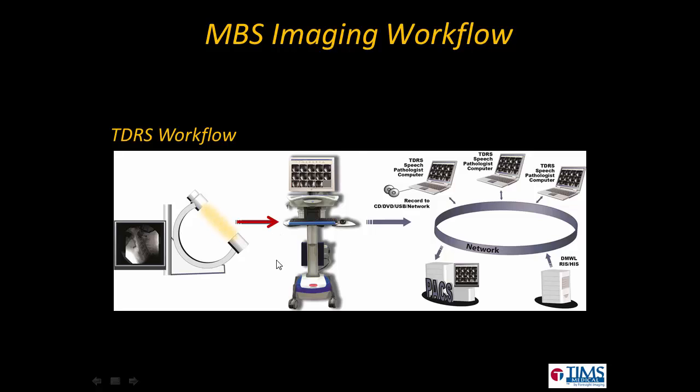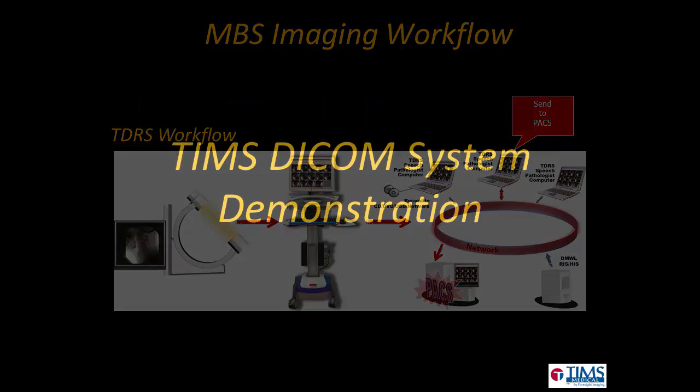This time we'll fluoro the patient, use the TIMS system in the procedure room to just record the study, then immediately send the study over the hospital network to the TIMS DICOM review workstation back in the speech office. From your TDRS workstation, you can review the study with its audio, make any necessary edits, and then send the study on to PACS where it will be backed up and then attached to the patient record. This provides you with a much more flexible and efficient workflow.